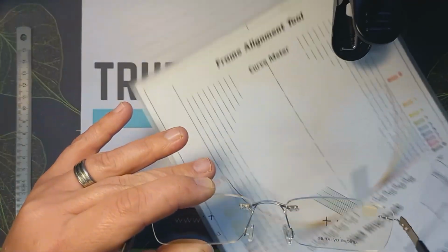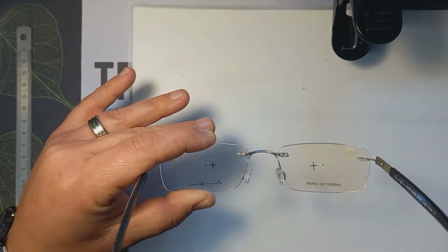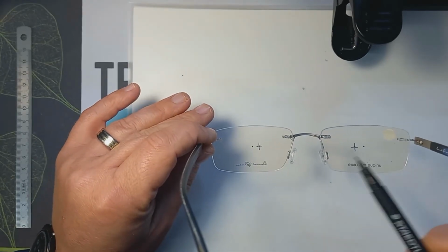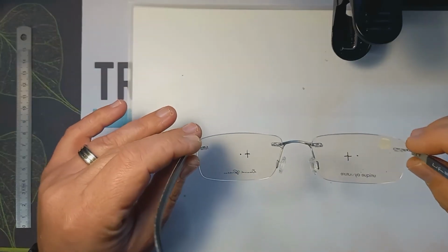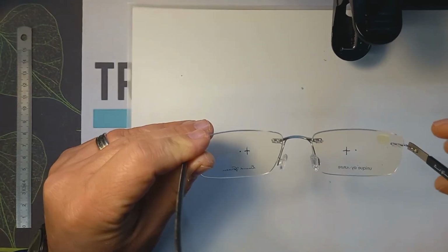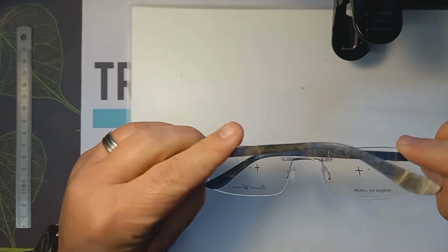Now you have a good reference between the two measurements. There's our patient's PD and our frame PD. Guys, I will make a future video on why these measurements are so important.